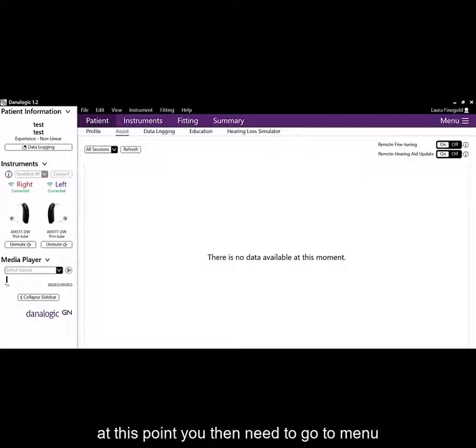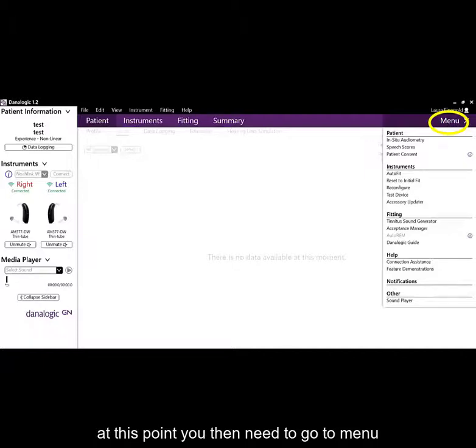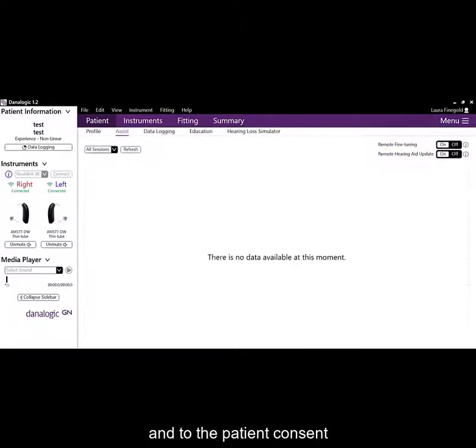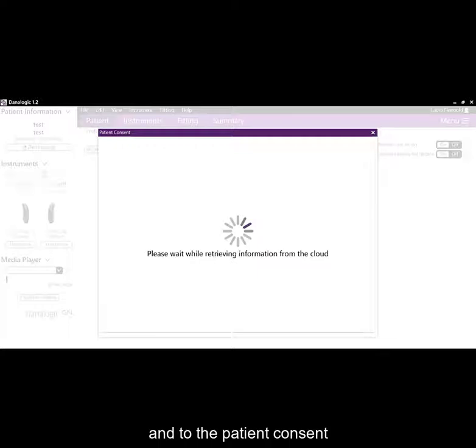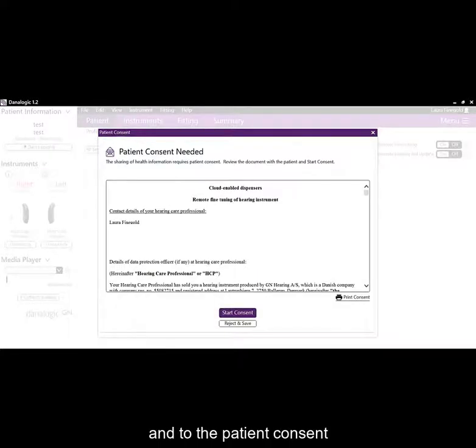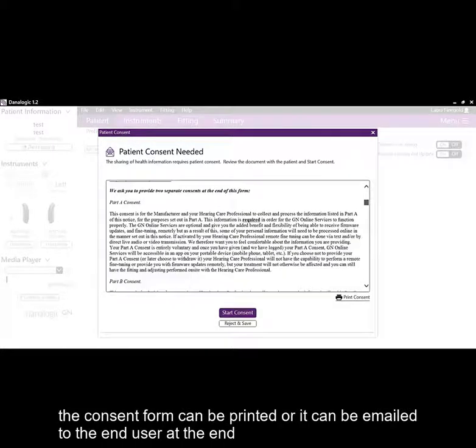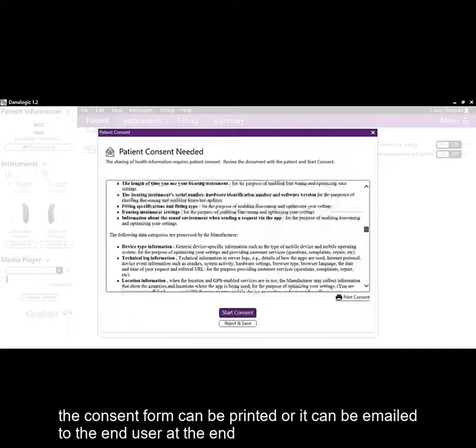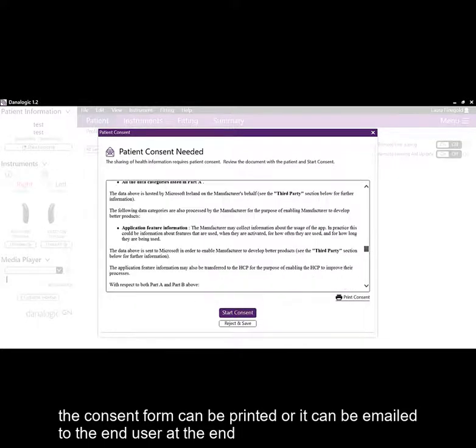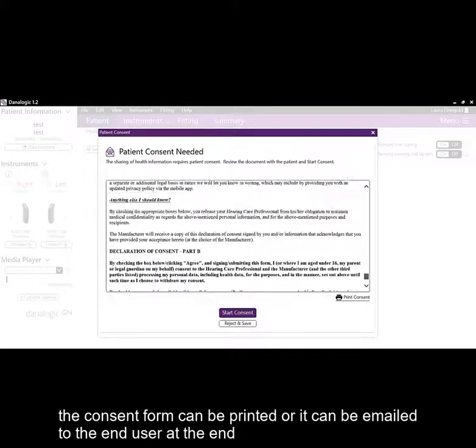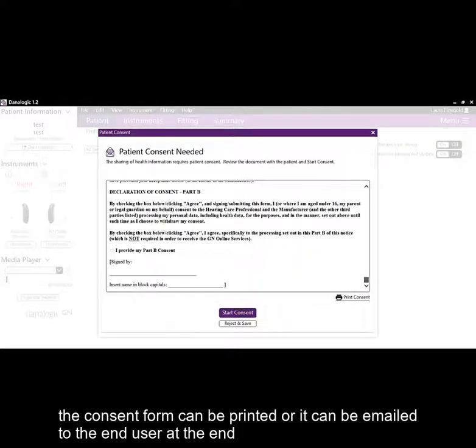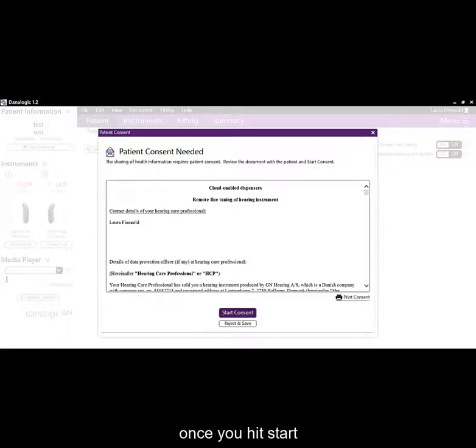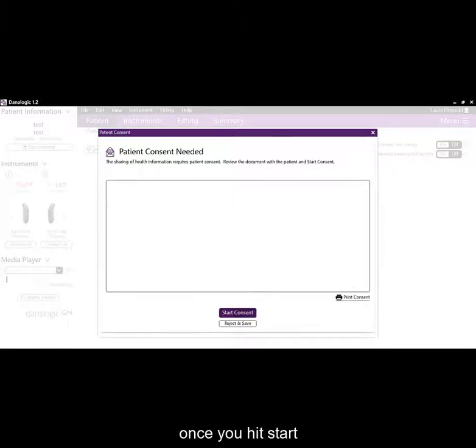At this point, you then need to go to menu and to the patient consent. The consent form can be printed or it can be emailed to the end user at the end. Once you hit start, there are two parts to the consent.